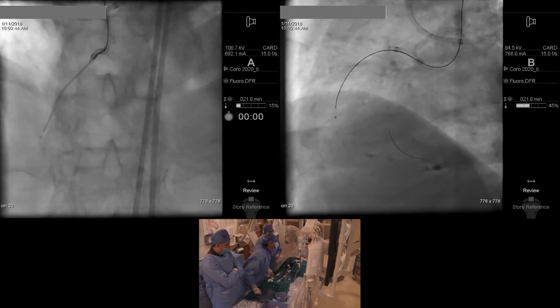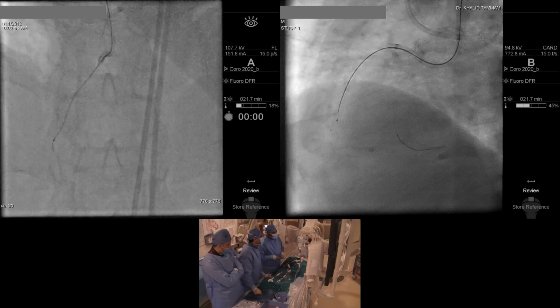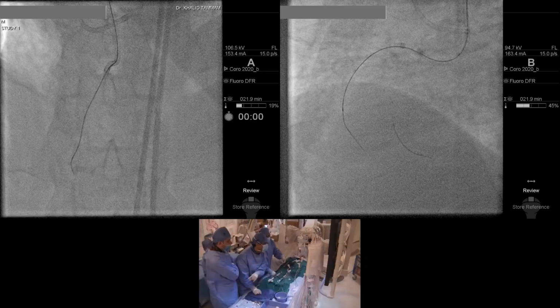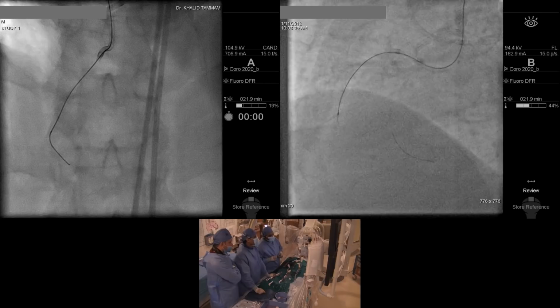That's what I understand. I would like just to go with the calcium there. Okay, good. Okay. No, it's out. Flow is off. Cannot see here. Okay. No, but I'm out here. Wait, I'm not in the calcium. Another branch. You're out in another branch.